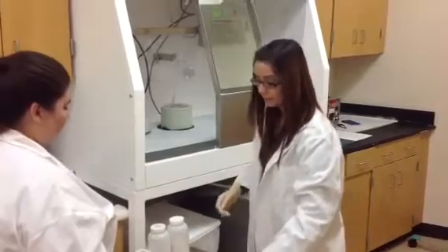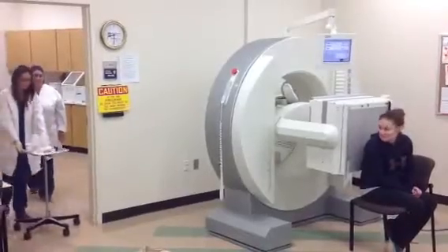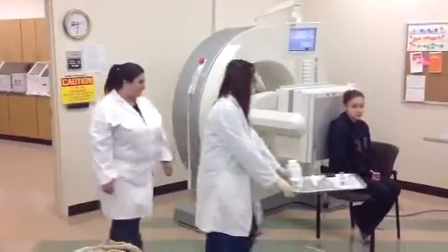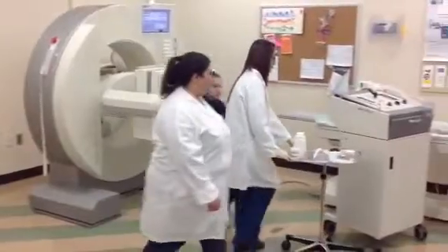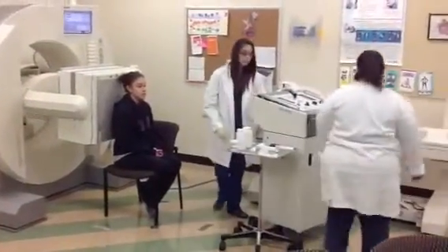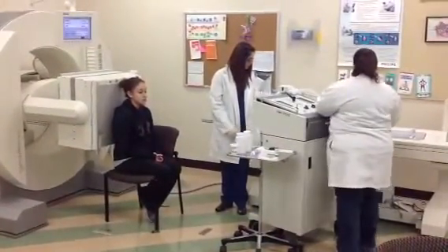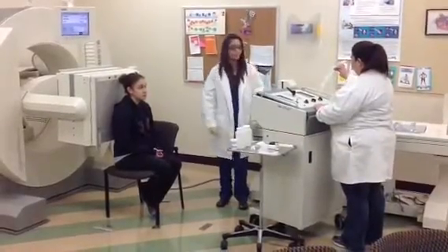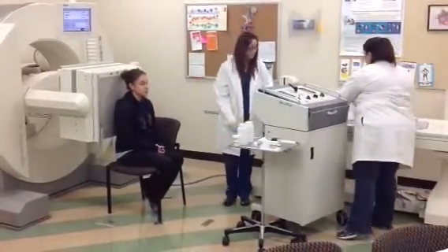Switch the handle to single breath equilibrium position number 2. Use either an injector gun or a syringe filled with xenon and puncture the injection site of the face mask, mouthpiece, or direct dose adapter. Add xenon as the patient takes a deep breath. Instruct patient to hold breath for as long as possible. After exhaling, the patient should resume normal breathing while you increase the patient airflow control to 40.